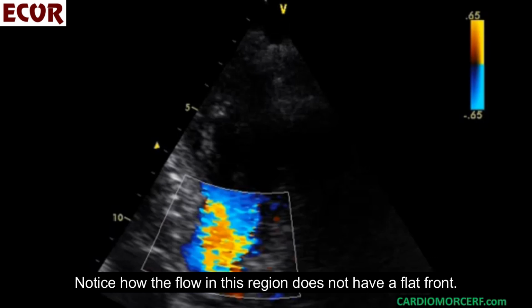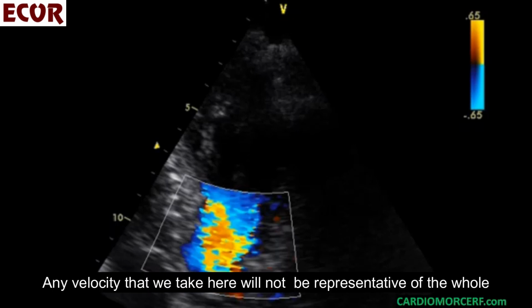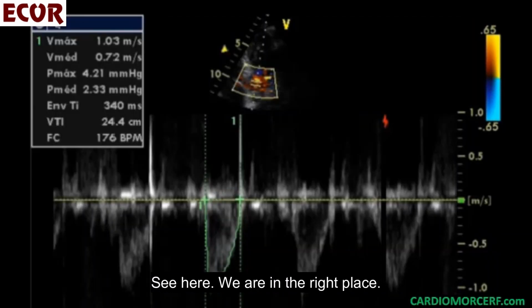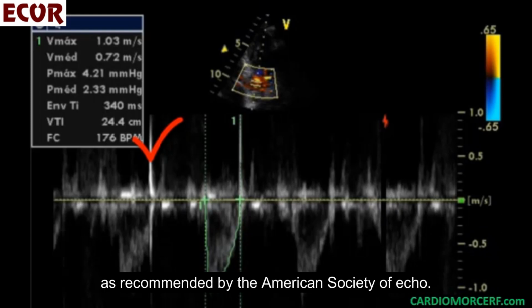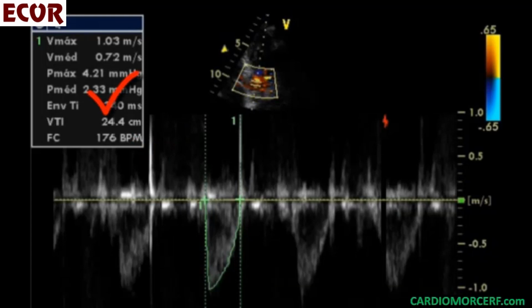Notice how the flow in this region does not have a flat front. There are regions with higher and lower velocities. Any velocity that we take here will not be representative of the whole subaortic region. See here, we are in the right place. Watch the closing click of the aortic valve as recommended by the American Society of Echo. The planimetry gave us a VTI of 24.4 cm.